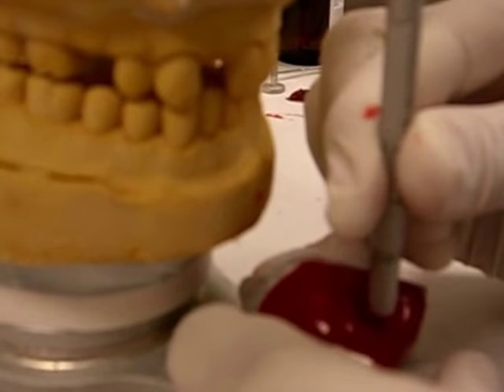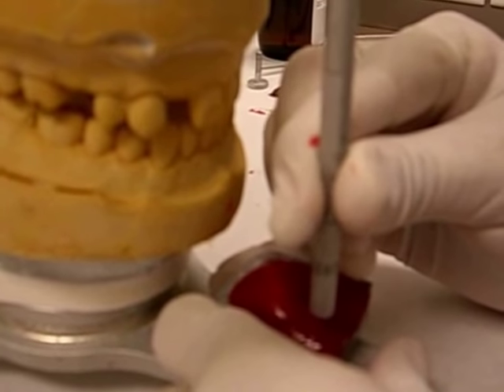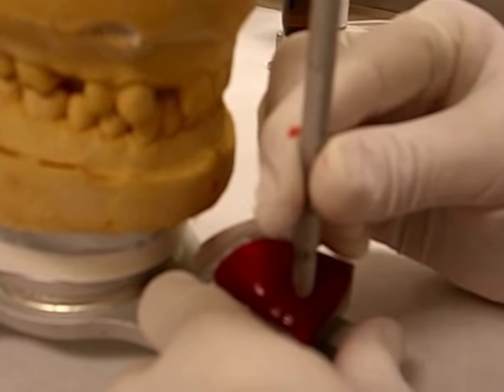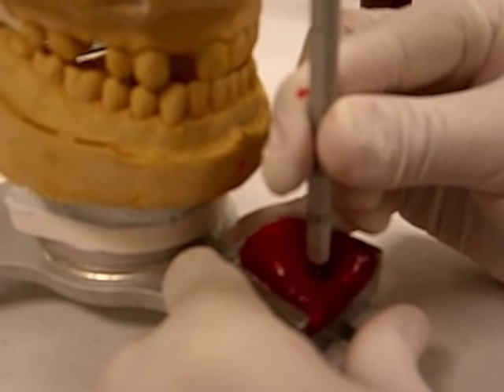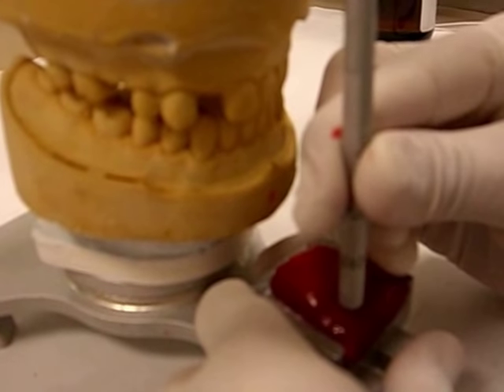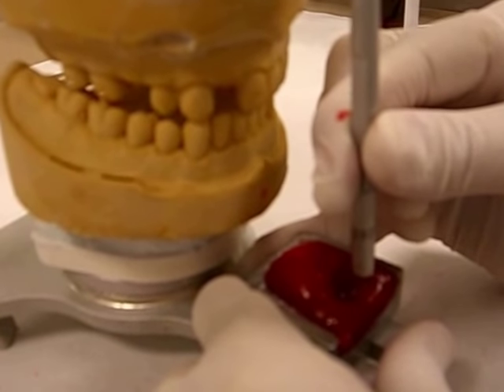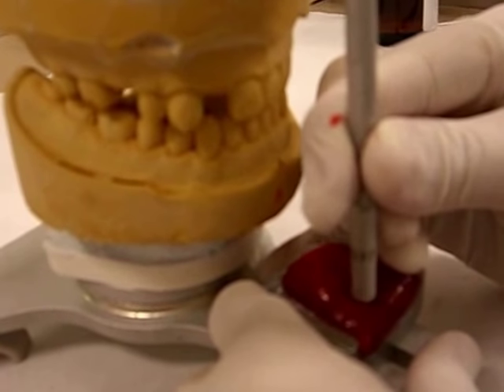Make sure the canines touch all the way to the tips. Make sure you don't pass that tip because what we're trying to record at this point is the Bennett movement, or the lateral side shift. If you go past the canine, the Bennett angle changes and becomes smaller. Or if you don't reach the canine, it also produces a smaller Bennett angle. You can tell that the acrylic is already setting — this sets in about 30 seconds — but it gives me enough time to record all the excursive movements.